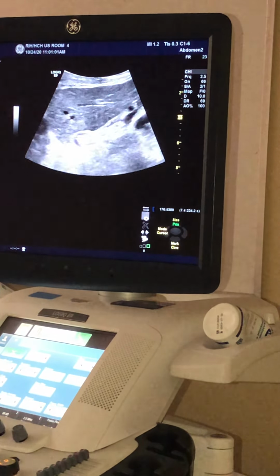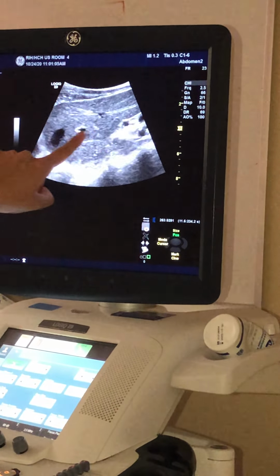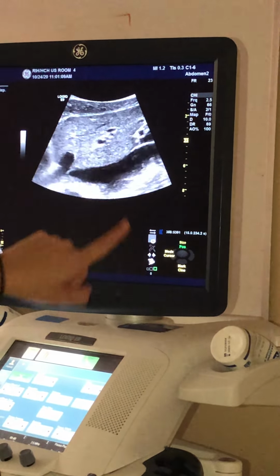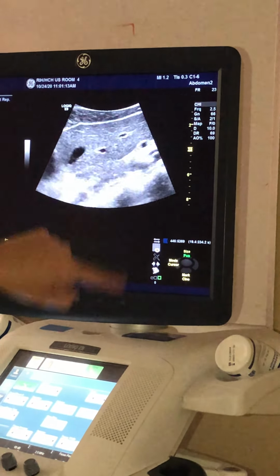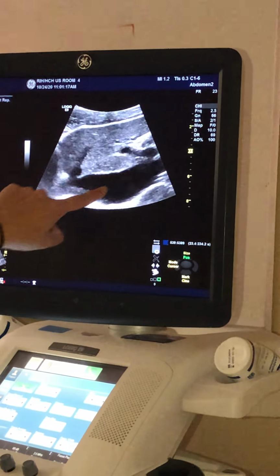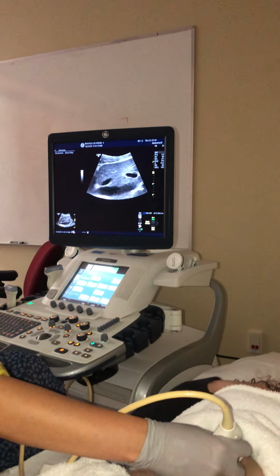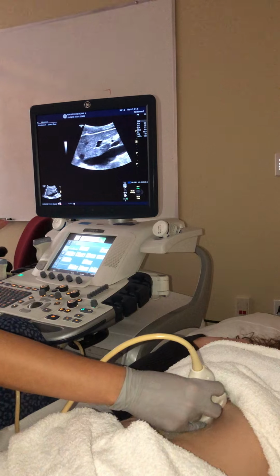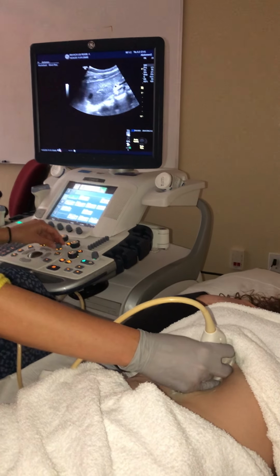So big breath in and hold. And we sweep through that, and just watching this area, we see our aorta, we sweep in a little bit more. That area is becoming a little bit more prominent, and then we get our IVC. So as we sweep through, you can see this little bulge of tissue, and that is our caudate lobe. Breathe. So our aorta, our caudate lobe, and our IVC are all going to be landmarks that we use when we're taking our pictures.